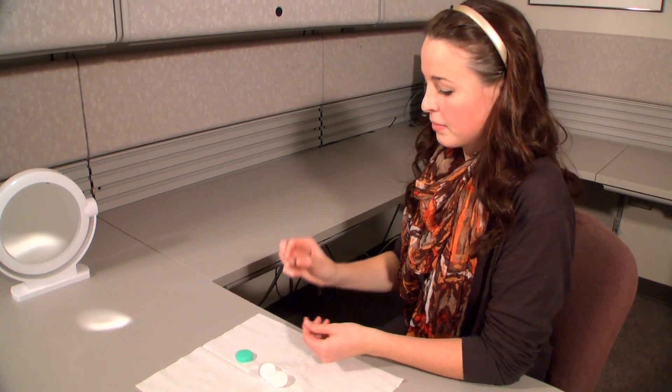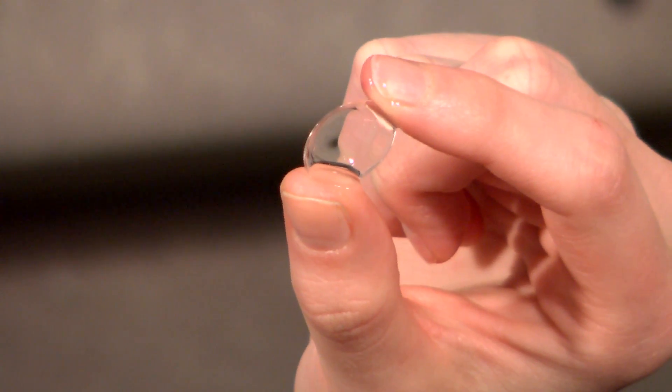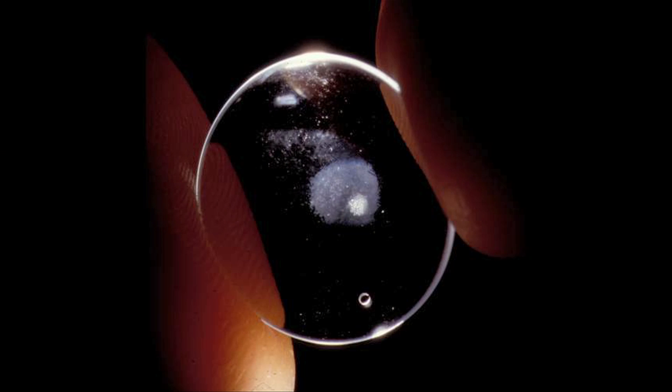Inspect the lens to make certain there are no chips, cracks or debris on the surface. You can hold the lens up to the light to see if there are any deposits inside the lens bowl. Deposits may make the lens look white or cloudy.